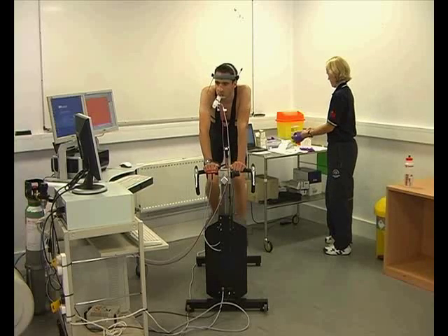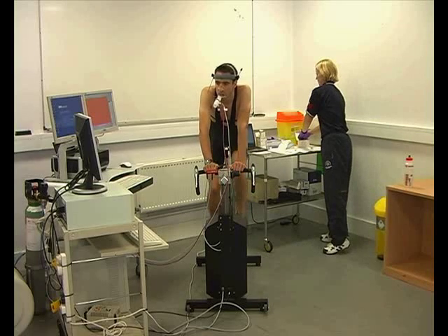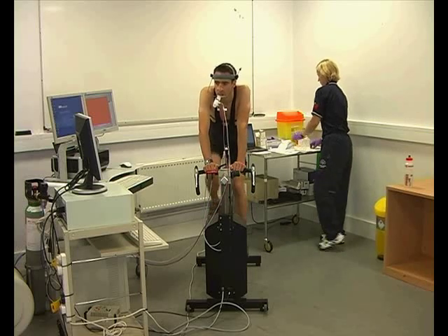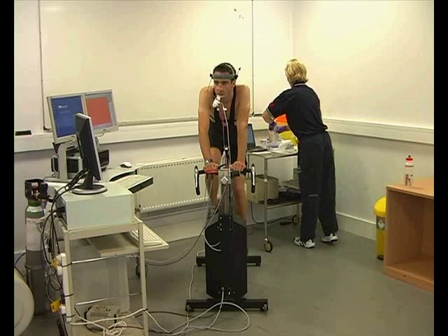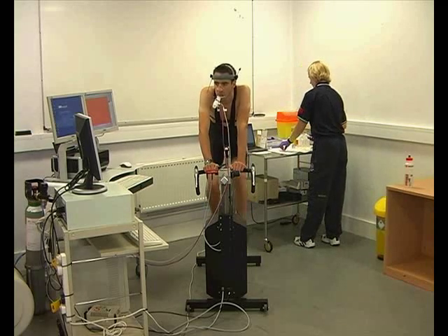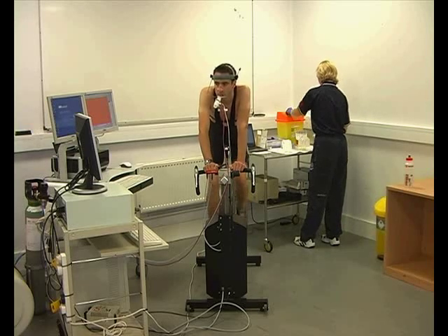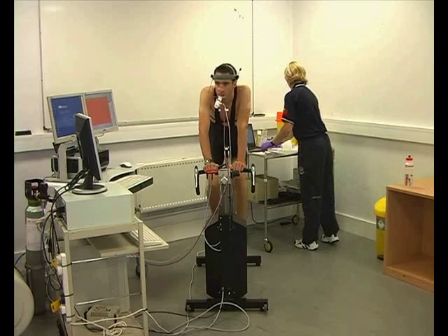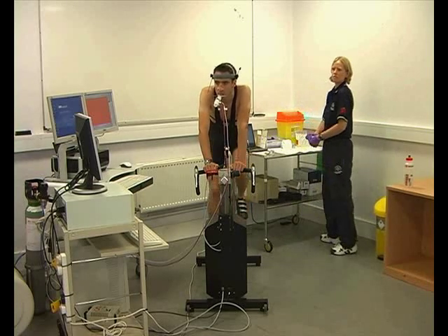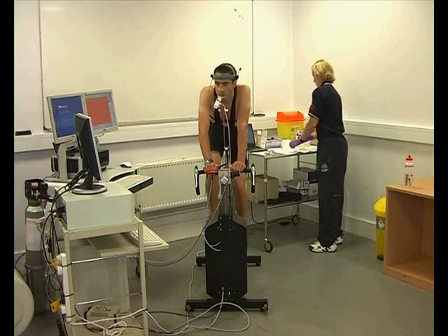We need to get ready to take the blood samples. So, on go the purple gloves, getting the blood collection tubes ready, a small needle to put into the lancet. We take that needle and load the lancet up. And we've now got everything ready to take our blood sample at the end of each 3-minute stage.